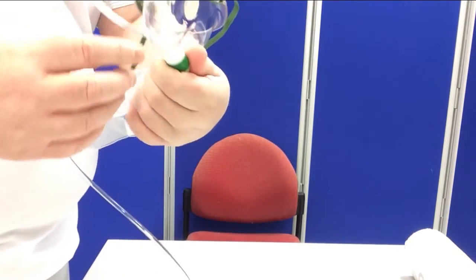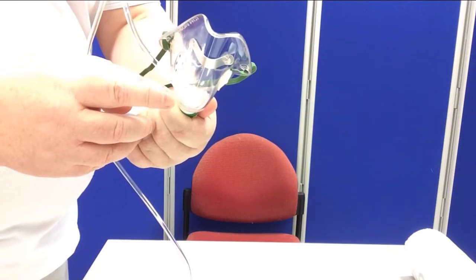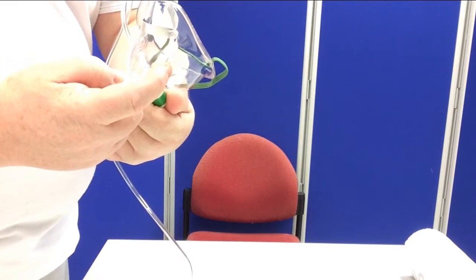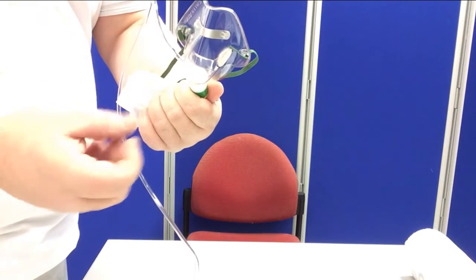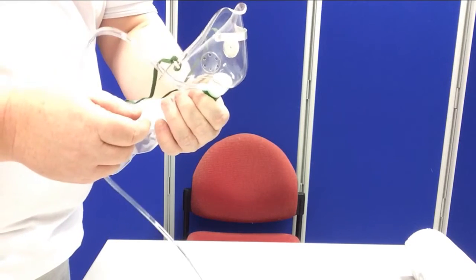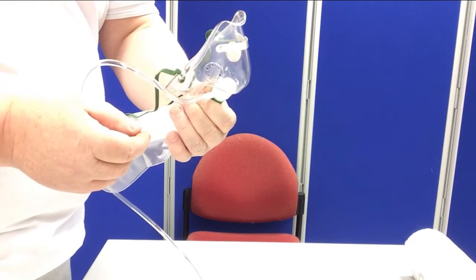You'll see on most masks that there are two valves, one on the inside and one on the outside. This allows mostly a one-way flow of oxygen. Some masks will have more valves, some masks may have fewer.